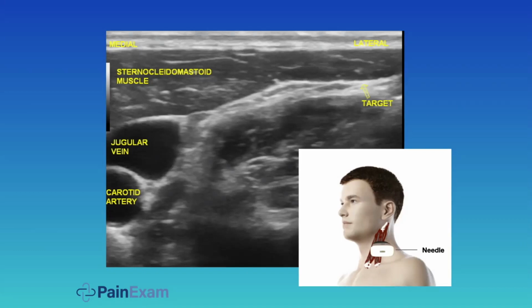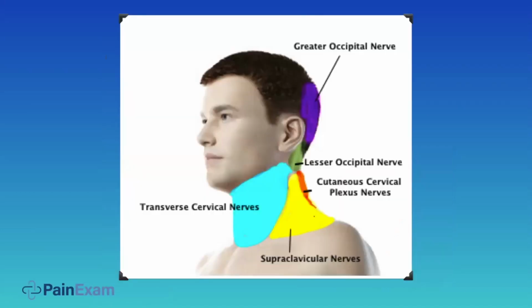Okay, it's like a plane block because it's hard to see each individual nerve, but these little white dots here are probably the nerve. It's a sensory nerve. This is a distribution of the nerve. Okay, it's a pretty large distribution, so it's actually a very useful shot. You could probably use it for cancer pain as well.